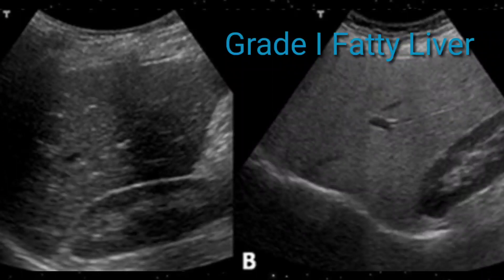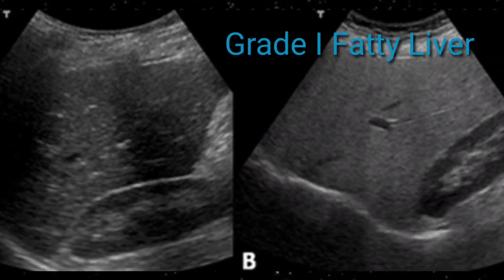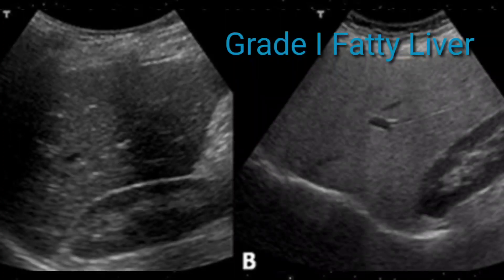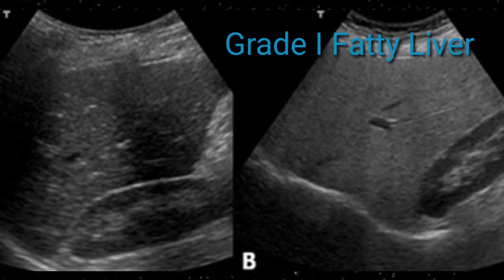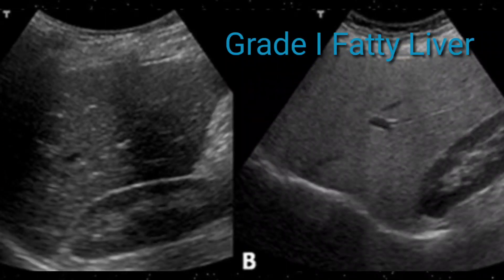This image shows a comparison of liver echogenicity with renal cortex echogenicity for fatty changes. On the right side, liver echogenicity is equal to renal cortex with no fatty infiltration. On the left side, liver echogenicity is increased compared to the renal cortex. In Grade 1 fatty liver, the liver appears echogenic and intrahepatic vascular markings are visible — you can appreciate the portal veins with their echogenic walls and also the hepatic veins.